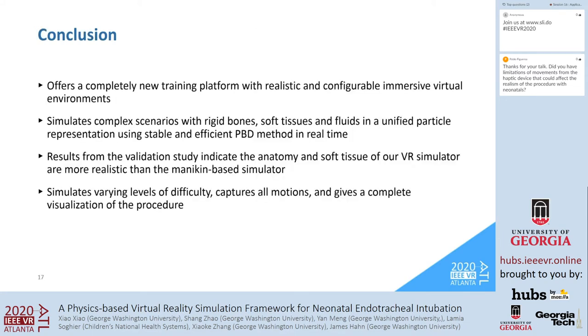So in conclusion, we have presented a practical and efficient simulation framework that offers a completely new training platform with realistic and configurable immersive virtual environments. Our simulation framework is able to simulate complex scenarios with rigid bones, soft tissues, and fluids in a unified particle representation using the stable and efficient PBD method in real time.